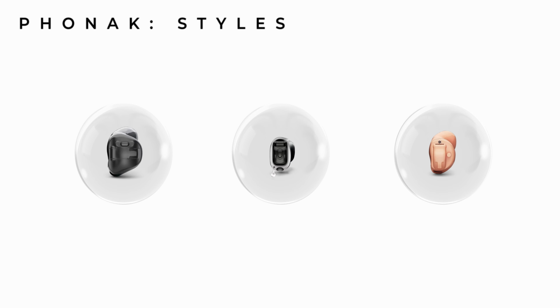As with all other manufacturers, the tinnitus feature needs enabling by your audiologist on Phonak's target hearing aid fitting software. Yet, differently to all other manufacturers, Phonak's focus is on providing you with broadband sounds rather than nature sounds that we saw with the likes of Oticon. In my opinion, their selection of three is a little bit disappointing. However, as I mentioned before, there's a lot of tailoring that can be done to those sounds.